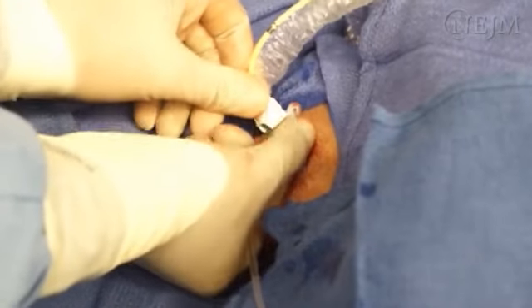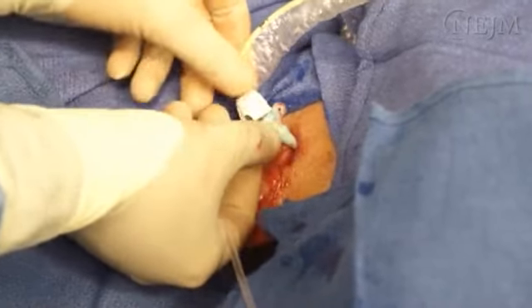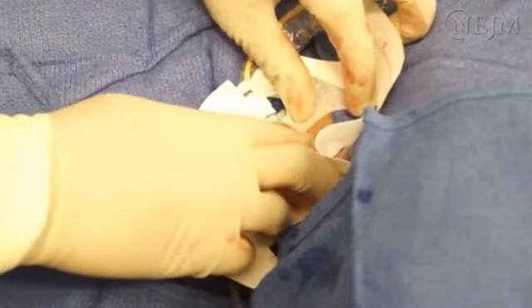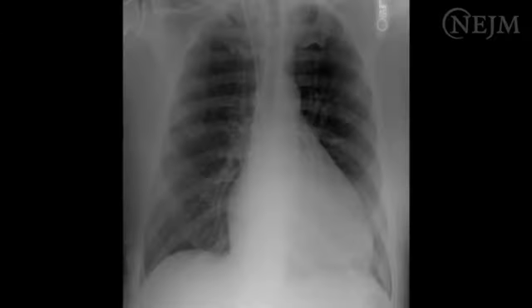Fasten the plastic sleeve to the sheath and secure the catheter. Suture the sheath to the skin and apply an antibiotic-impregnated adhesive dressing over the wound. Obtain a portable chest radiograph to confirm appropriate positioning of the catheter and to rule out a pneumothorax. The tip of the catheter should not extend more than 4 or 5 centimeters beyond the midline.